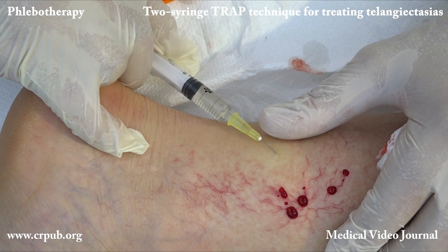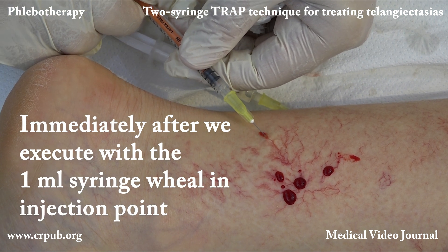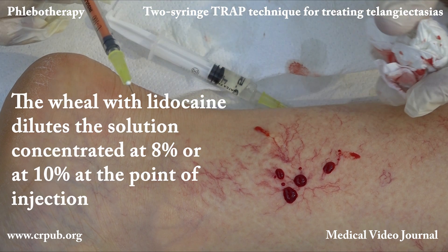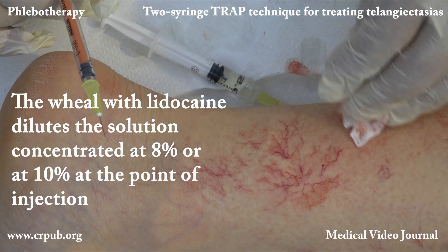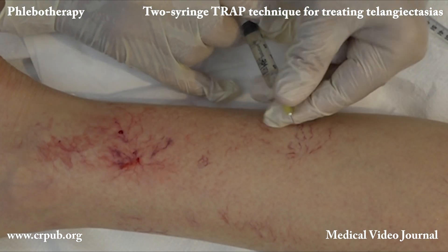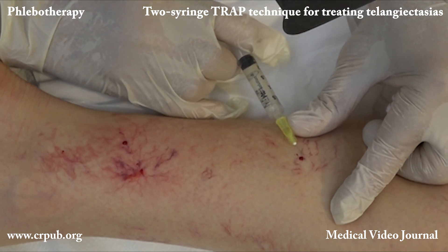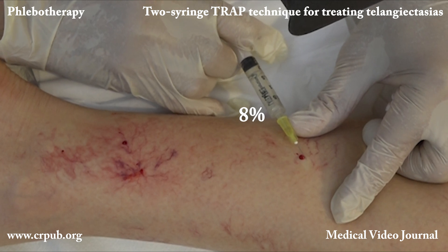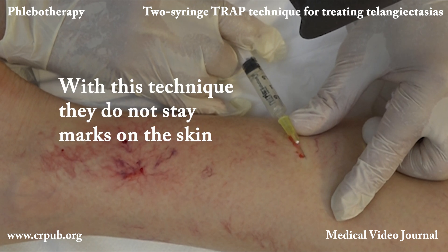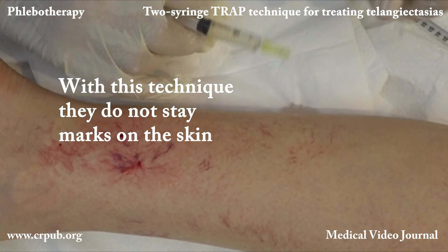Naturally, the higher the concentration, the higher the risk of a residual skin lesion at the point of injection, where a tiny wheal almost always forms. In this case, the 1 milliliter syringe is used to dilute the solution that has caused the wheal, thereby eliminating the risk of skin damage. The 1 milliliter syringe, which has a small diameter, enables the dilution solution to be easily injected into the thickness of the dermis. Dilution should be performed immediately after injection of the concentrated solution; for this reason, the 1 milliliter syringe must be kept within easy reach on the table.